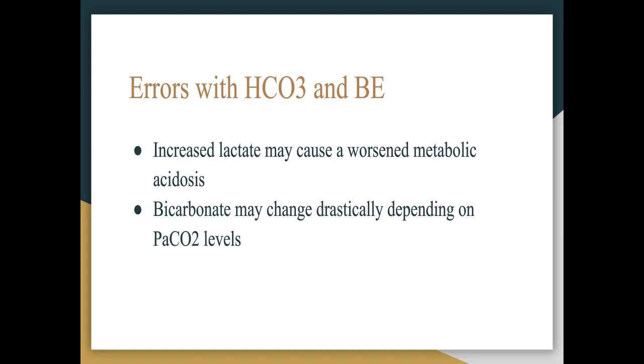The errors with bicarbonate and base excess are often less significant than those of other analytes. As we mentioned before, there may be dilutional changes in bicarbonate and therefore base excess with increased levels of sodium heparin. Increased lactate levels due to altered sampling time may cause a worsening metabolic acidosis as reflected with decreased bicarbonate or base excess. Bicarbonate levels may also drastically change depending on the CO2 levels, which are dependent on the listed variables in the previous slide.